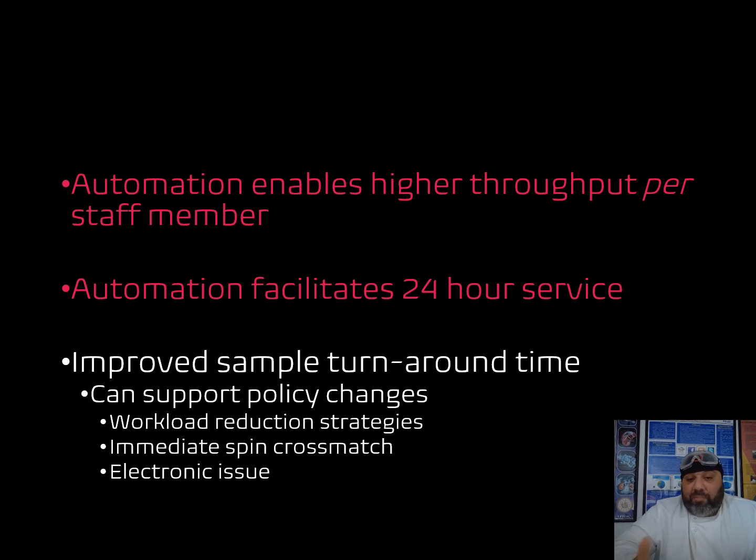the processes around particular blood components and preparing blood components have become much safer, at least in one context. Manual cross matches for particular patients are only really a requirement from a serological point of view, where patients may have various antibodies. So the spin cross match and the electronic issue in transfusion practices allow an improved turnaround time, so that patients who require particular components of blood receive them that much quicker.